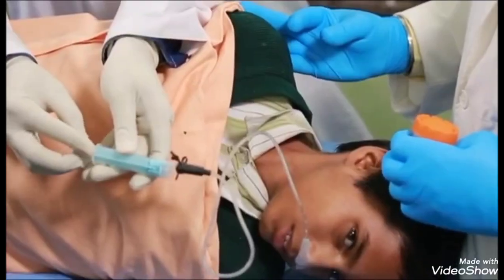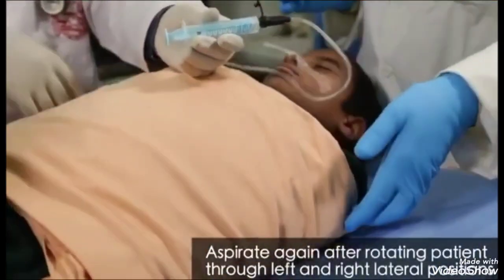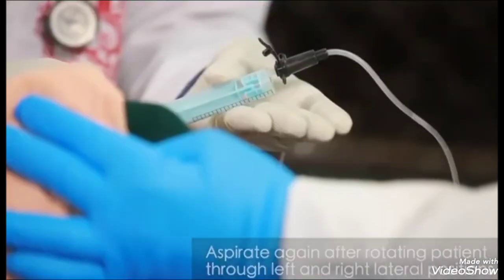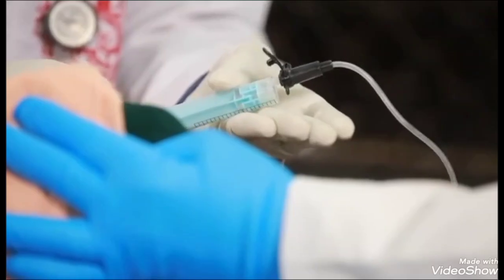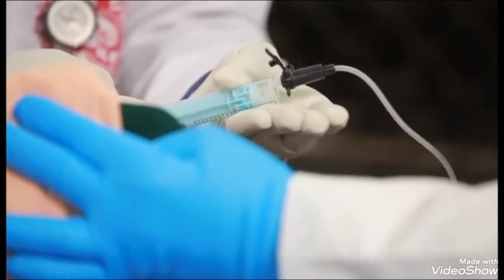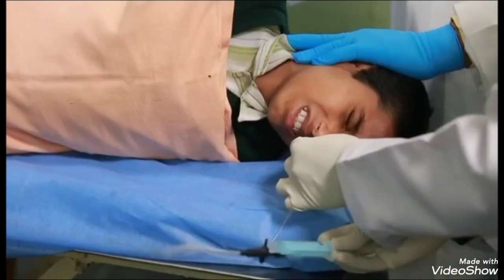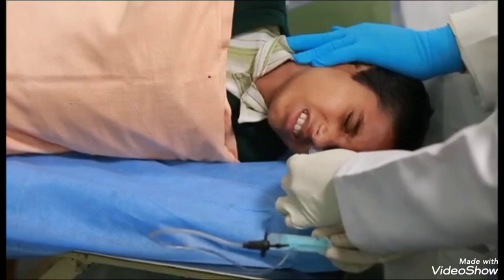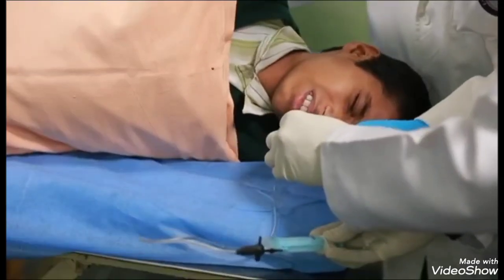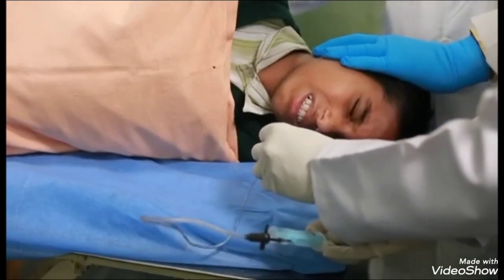If there is no aspirate or the quantity is inadequate, try re-aspiration after shifting the patient in the left and right lateral positions. If one still does not get adequate specimen in both supine as well as lateral positions, further aspiration can be retried by shifting the tube a little in or out in an effort to hit the stomach contents. The repeat aspiration should be done while rotating the patient through supine and lateral positions.